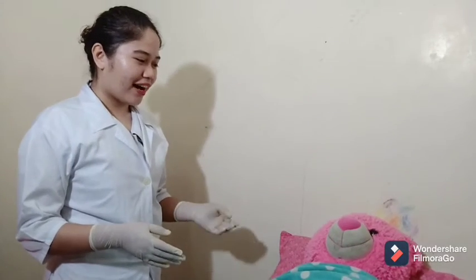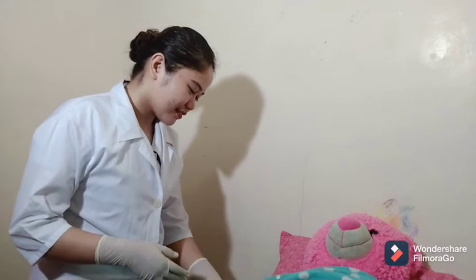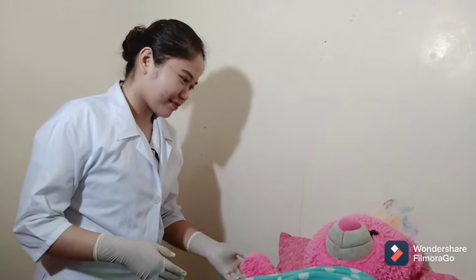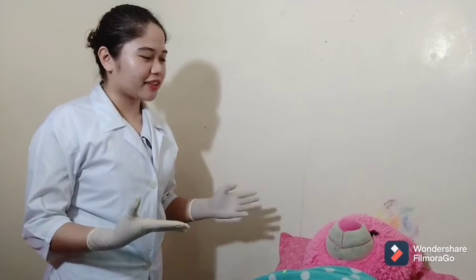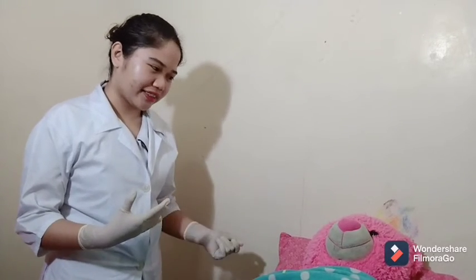How are you? Are you Shaira? And now, I'm going to remove the indwelling catheter. It is a bit painful, but you can tolerate it.